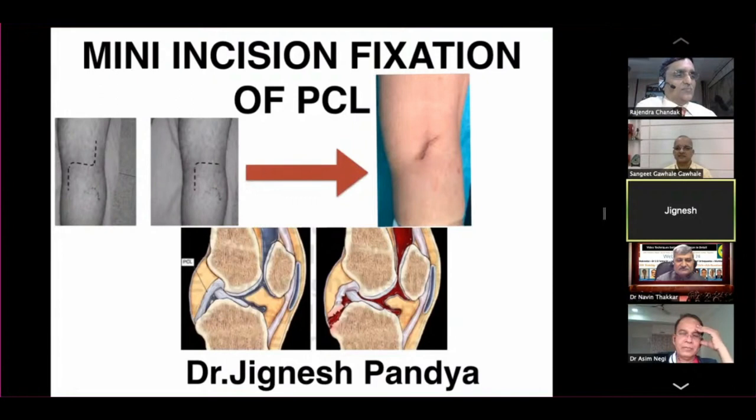So these all three incisions — you can see how we can reduce the morbidity of incision and dissection. Almost we are doing the same dissection, but we are doing it in a very delicate way and just directly reaching to the fragment and fixing the fragment under vision.